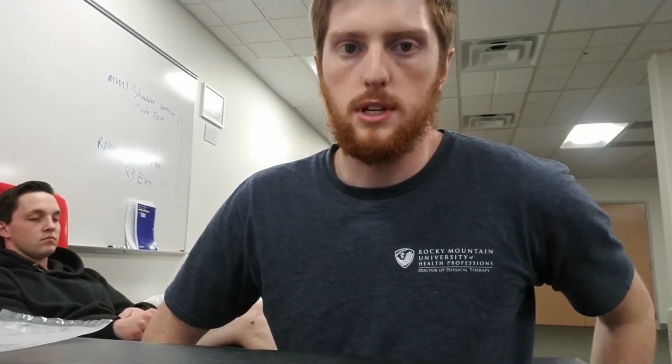Okay, so for this patient, we're going to use biphasic pulse current. We'll do high rate TENS. For pain control, we're going to do a pulse duration of 80 microseconds, pulse frequency or pulse rate of 80 pulses per second, and then we want to use an amplitude comfortable for the patient. So we'll do a comfortable tingling, and we'll do it for 20. Usually it's 20 to 30 minutes, but we're going to focus on about 20 minutes since this is his first time.